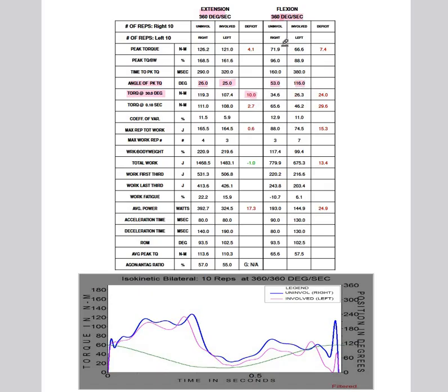So the right is occurring almost spot on. This is atrocious on the left hand side here. There's a real functional deficit here. So this point here at the knee flexion would definitely warrant consideration. You've got peak torque occurring at two very distinct regions, and on the left side it's happening when the knee is almost at the full range of motion.